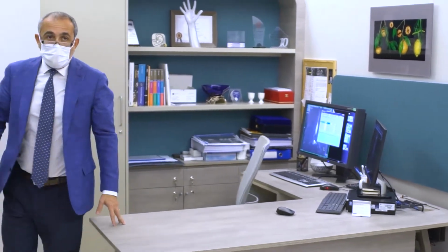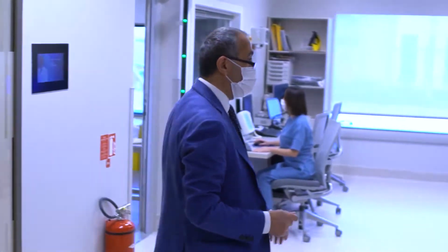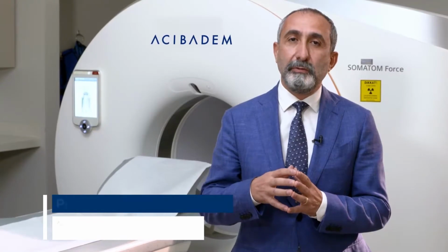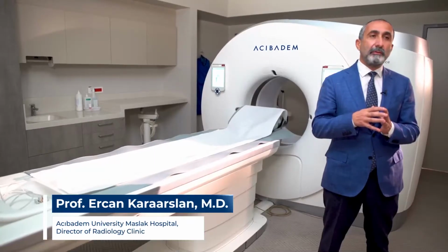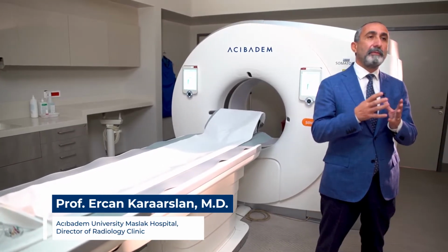Coronary artery diseases are among the most common causes of death around the world and in Turkey. Risk management with high-tech computerized tomography (CT) coronary angiography, which can image the diseases of coronary artery walls before onset of coronary artery disease, gains importance for this group of patients.